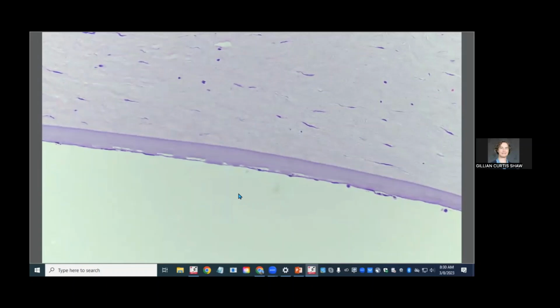The interesting thing about corneal endothelium is that in flat section, if you ever serendipitously happen to catch it flat on a histologic section, or of course there are many people who have done it on purpose, it's very, very pretty. It looks like a hexagonal mosaic, kind of like a beehive. And oftentimes in this condition, it'll be very disarrayed and not as closely packed a mosaic as usual. And I would strongly encourage you to find papers with some electron microscopy and other things like that to check out endothelium.